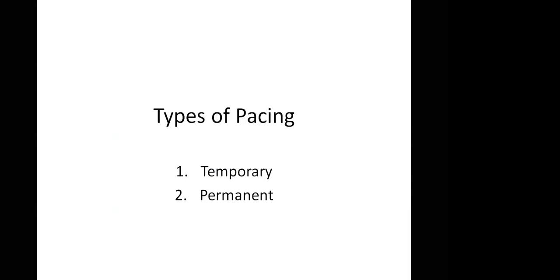Sorry, just one second. I'm trying to bring out a picture of what it looks like. Remember, I first made a comment that you can pace the heart from the surface. So this is the external defibrillator that can pace.